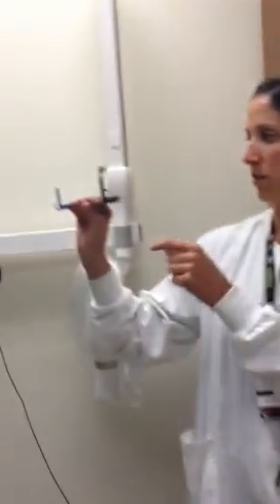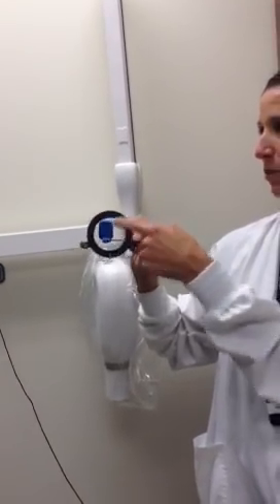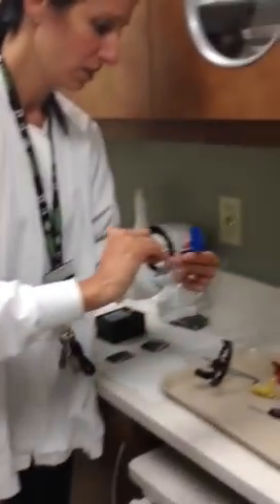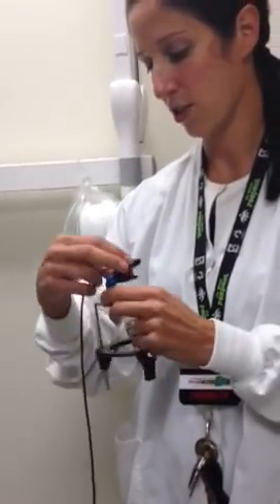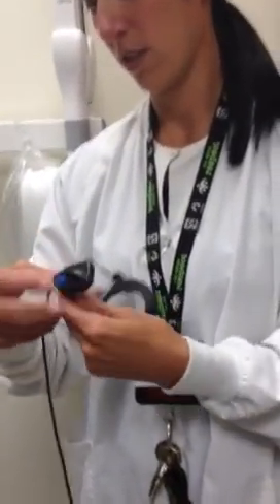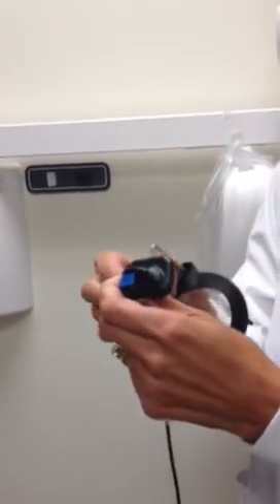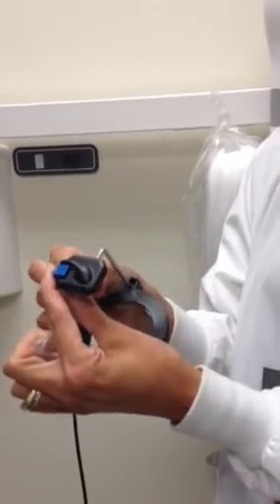You want to ensure that the sensor is in the center of the circle. The sharp pointy parts are always away from the client's face and the smooth part is against the client. So we will insert the sensor. It will guide you as to where to put the sensor cord into the little groove underneath.